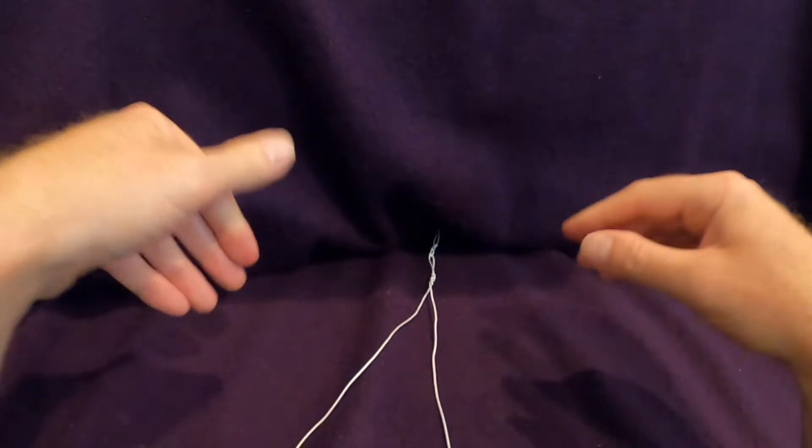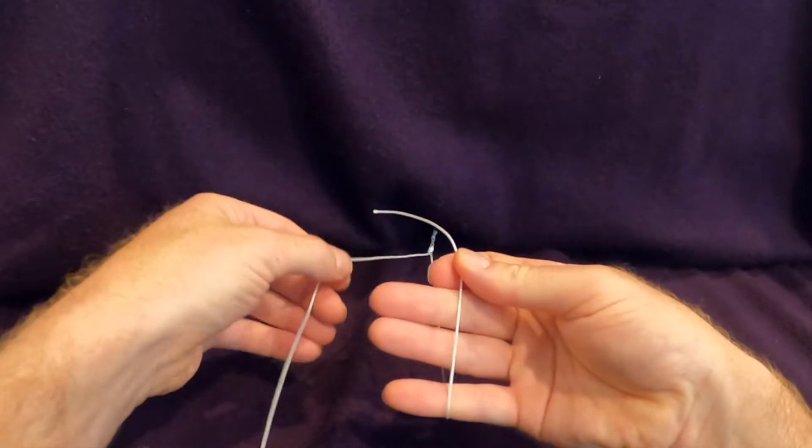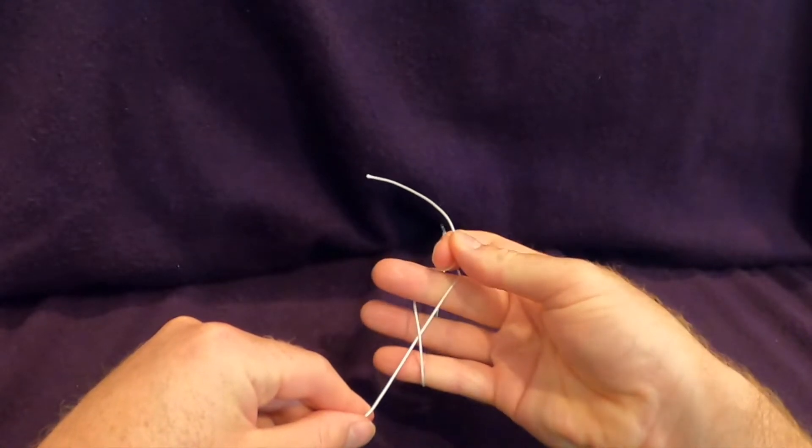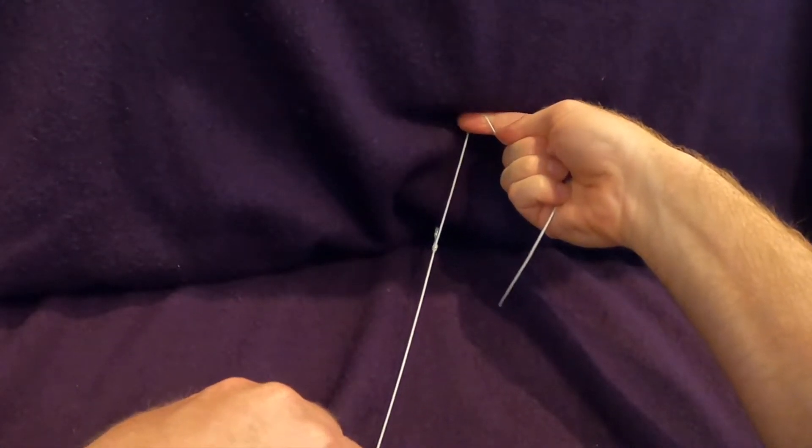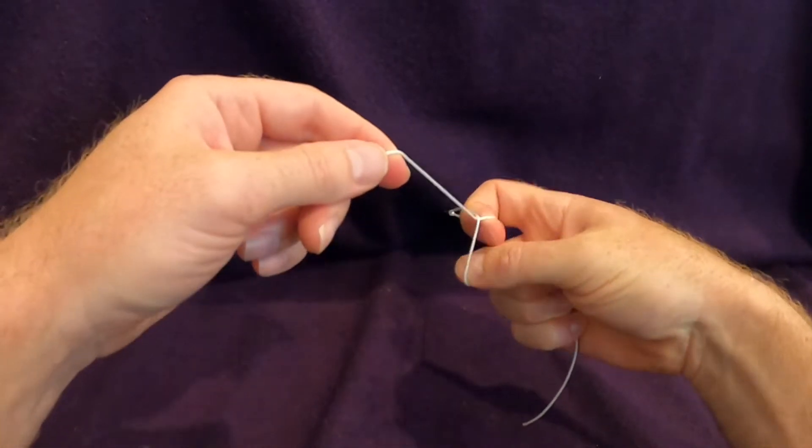Next, the other hand picks up the other suture and drapes it across the palm so that the tail is pointing in the opposite direction. The middle finger brings the suture through, the hand rotates and the knot is pulled tight.